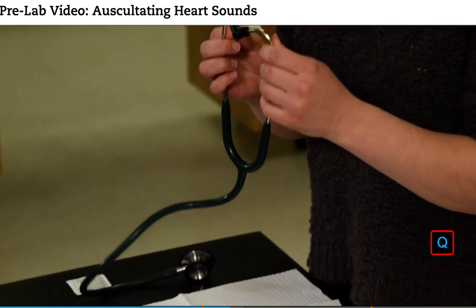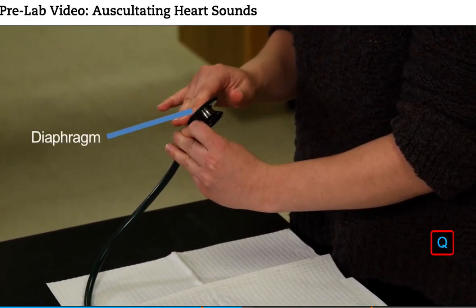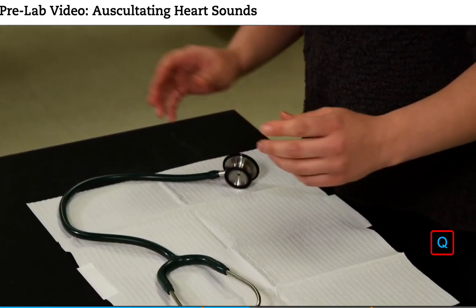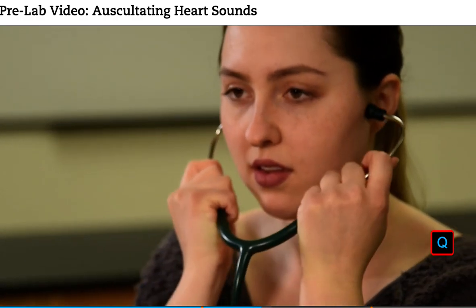Before using the stethoscope, use an alcohol swab to disinfect the earpieces and the diaphragm. Allow the alcohol to dry. When you push the earpieces together, they should point away from you, like the tip of your nose.